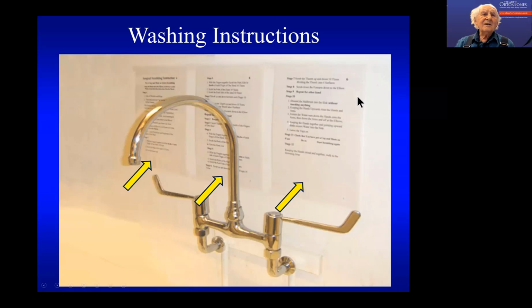On the wall here is the procedure for preparing one's hands ready to glove for an aseptic procedure. Ashwin, I believe you've got this laminated and next to your sinks. Have you seen this at Eldo's, Akshay? Yes, sir. You have seen it? Okay. Have you gone through this process yourself?